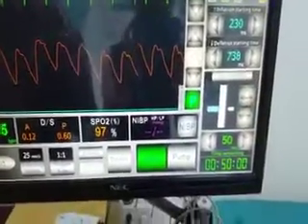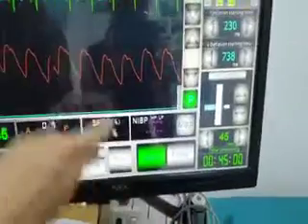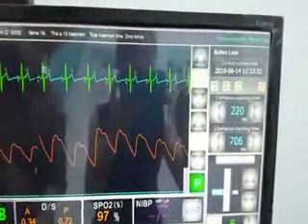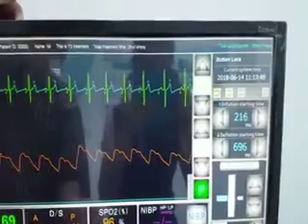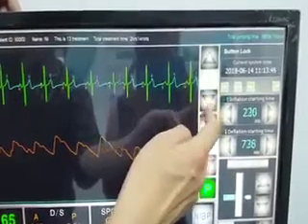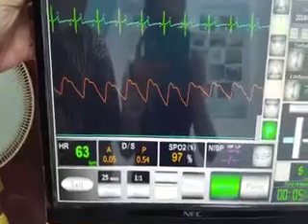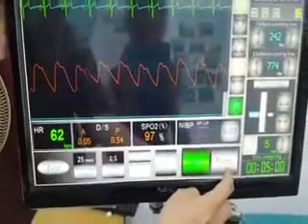Now we set up the treatment time. The minimum treatment time is 5 minutes and cannot be decreased further. Use the up and down arrows to increase or decrease the size of the waveform. The oxygen saturation is now displayed on the monitor. Press Pump to start treatment.